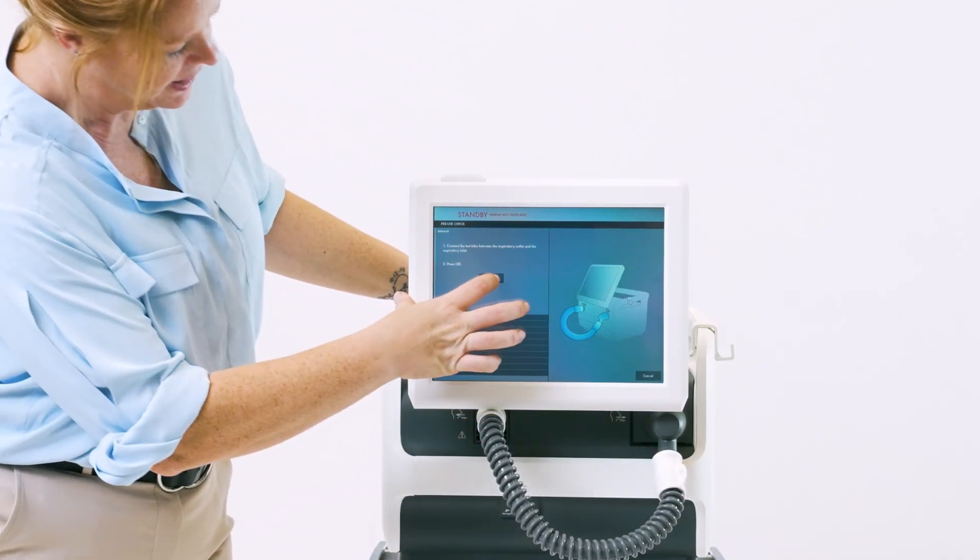Once that's completed, hit OK to start the testing. The pre-use check includes tests and measurements, including flow and pressure transducer calibrations.